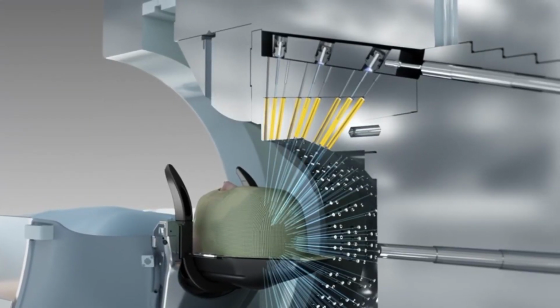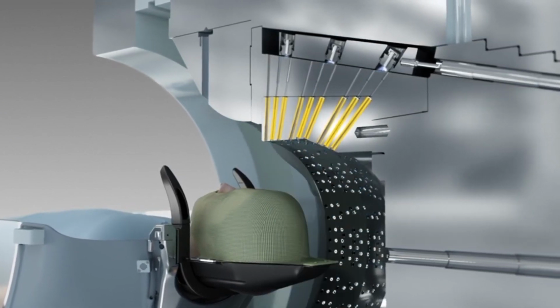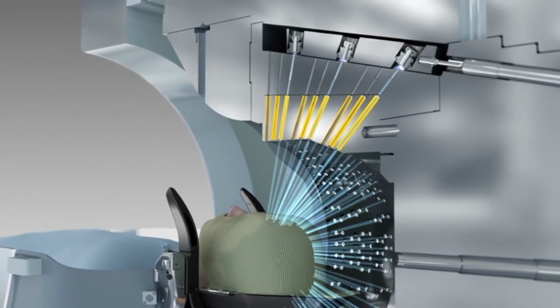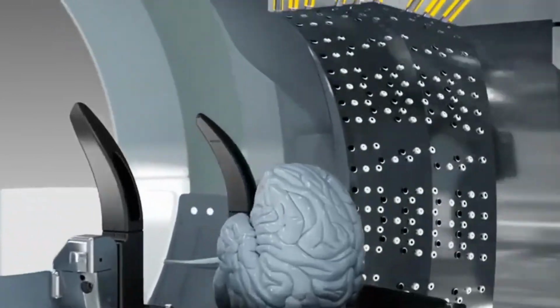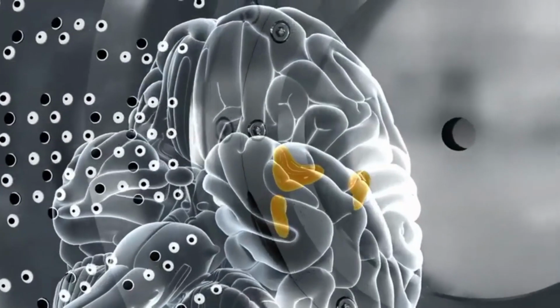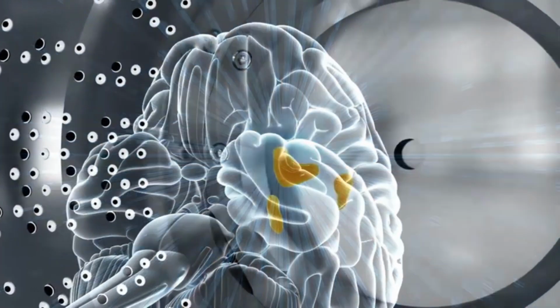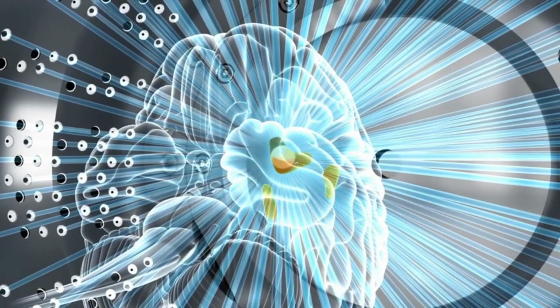During treatment delivery, the patient position is automatically adjusted to new isocenter positions, and the collimator sizes are changed without the need for any user interactions. The shape of the beam is adjusted, and by placing multiple isocenters within the target, the dose is built up to tightly conform to the target shape.